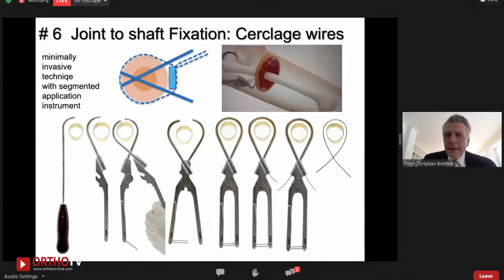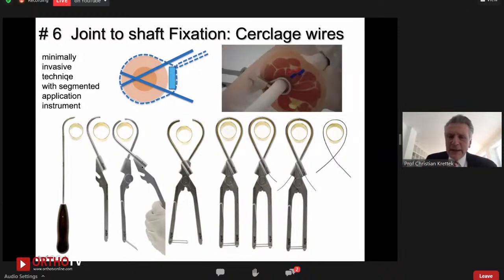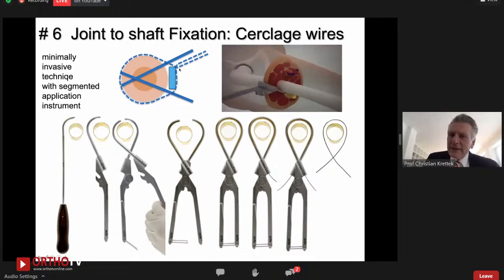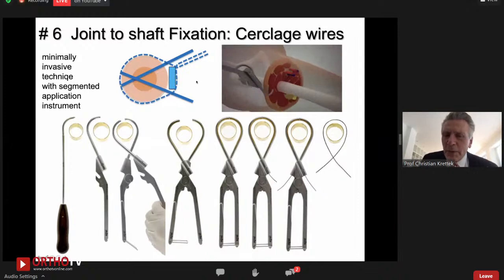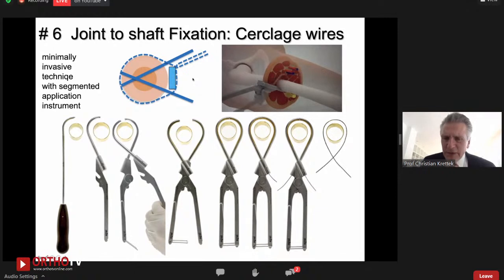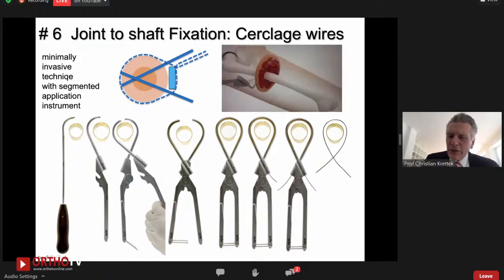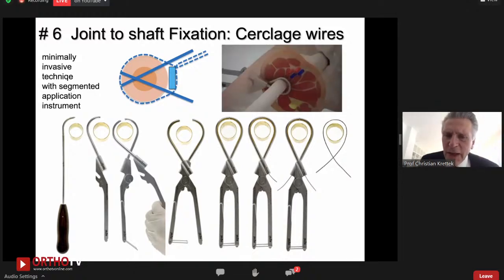Another tip is to use a cerclage either as a reduction aid. And with these two properties, cerclage and reducer, you can easily preserve the soft tissue nicely. You can gradually tighten or release the cerclage wire in order to play with your amount of stabilization until you have the final perfect result. The problem is always that you have to play with 6 degrees of freedom in each fragment, and you have to downsize these degrees of freedom. And the use of cerclage wires is one of the techniques where we can get gradually more stability during the reduction and fixation process.